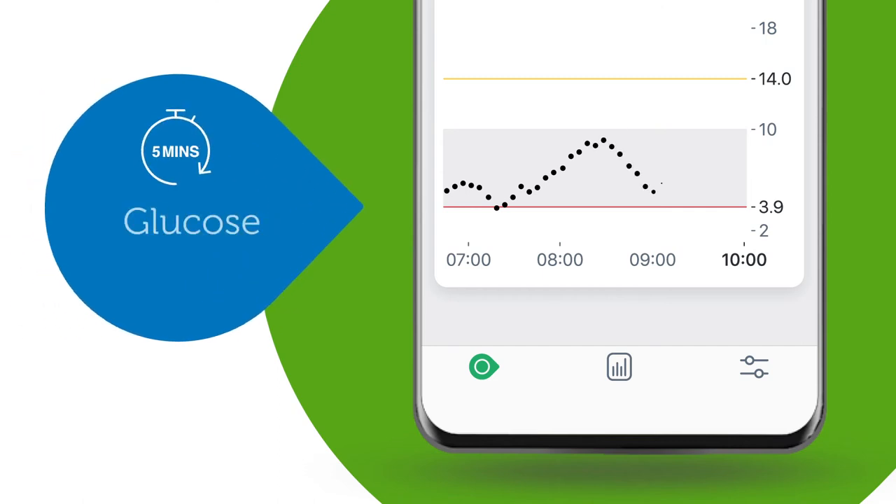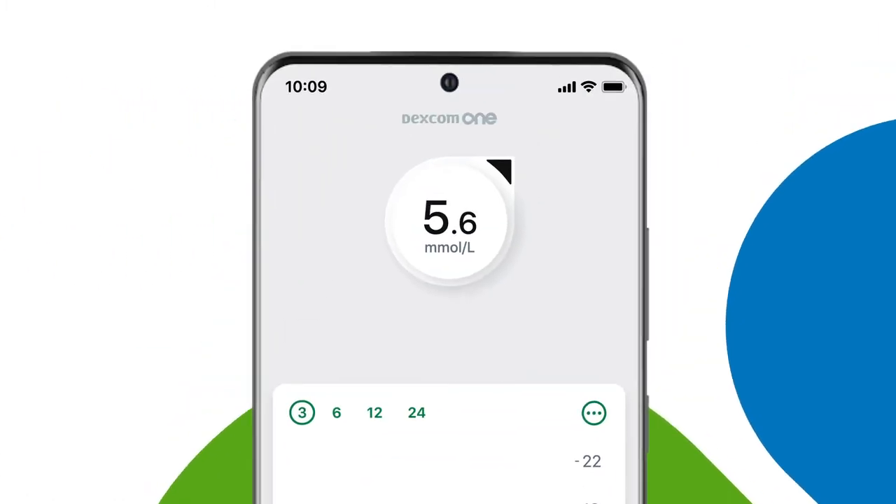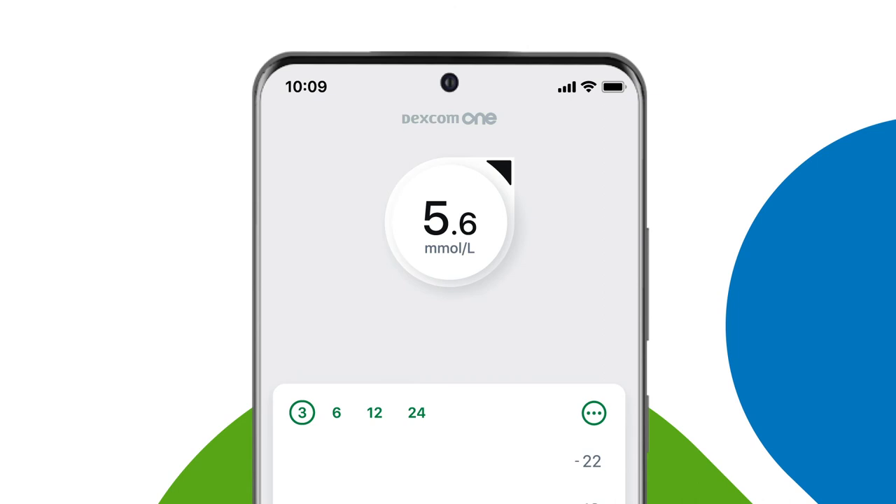So simple, and look what it can do. Each of these dots is a glucose reading taken five minutes apart, showing you how your glucose levels are trending over time. The app has arrows which show the speed and direction your glucose is heading — two arrows pointing down means you're dropping fast, one arrow down means you're dropping more slowly.